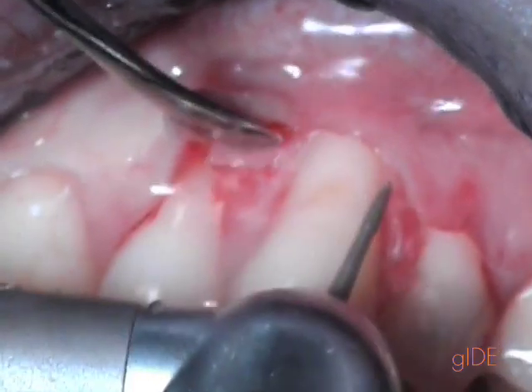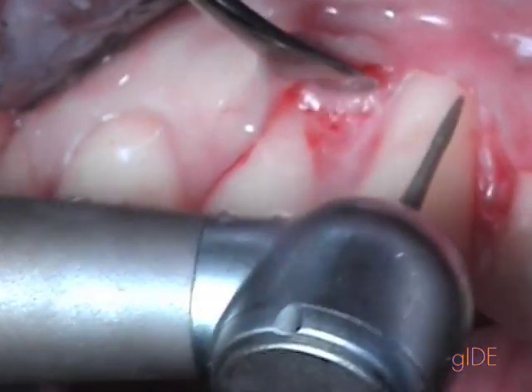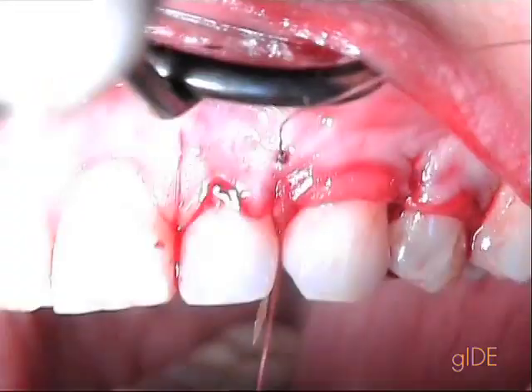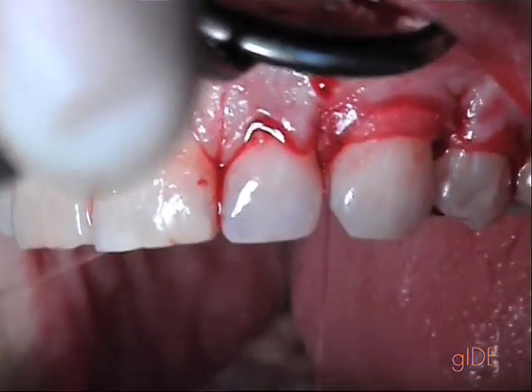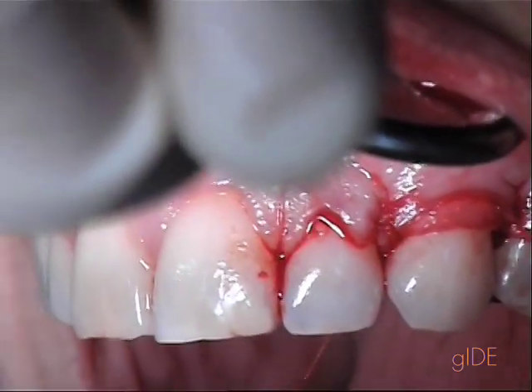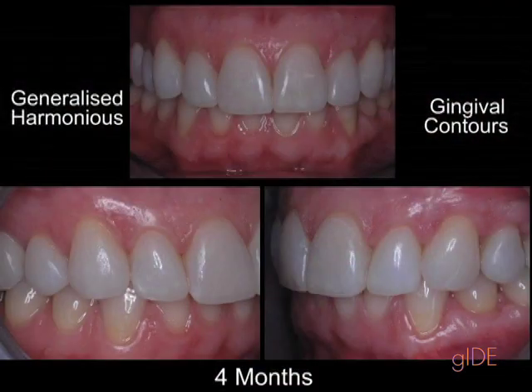I use my little diamond bur with very light pressure. There is a little mistake here — this is why I'm showing this video, because we do make some mistakes sometimes.